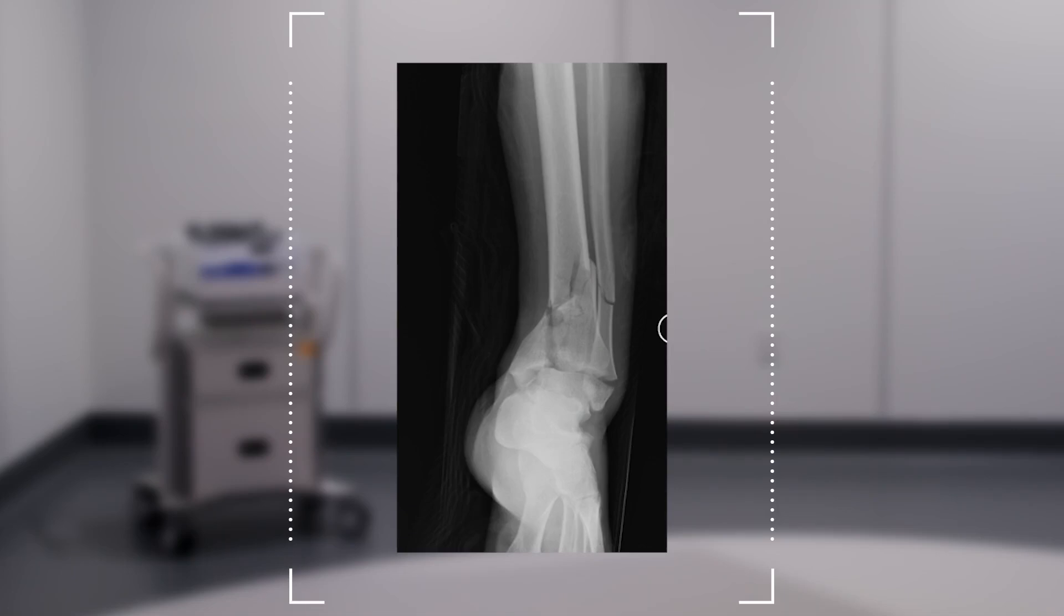Now, this is another example of a high-energy distal tibia injury where the talus is impacted and exploded the distal tibia. In this case, this is a 42-year-old male in a high-speed MVC.